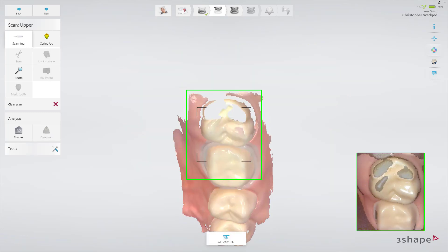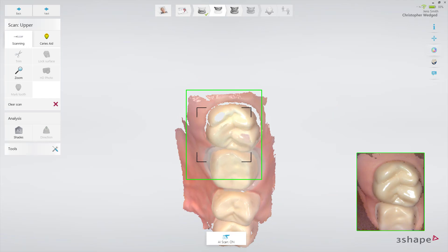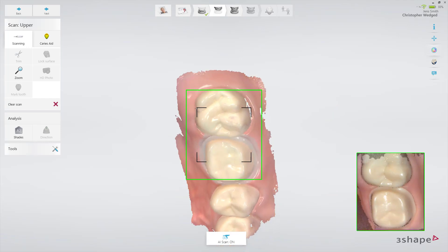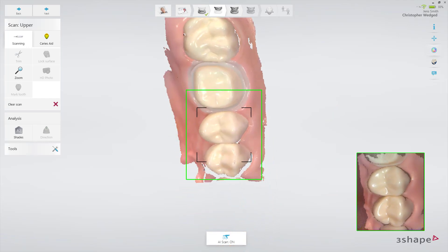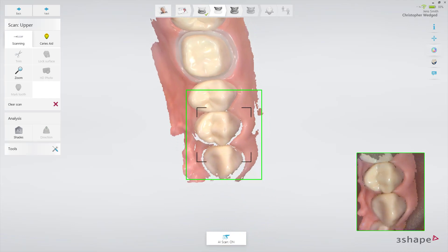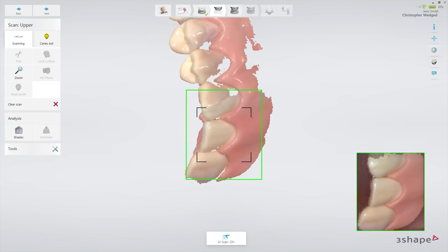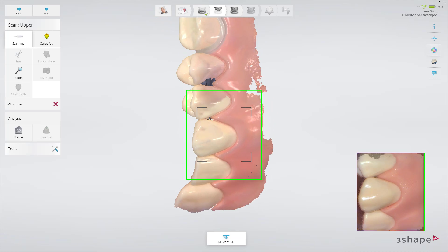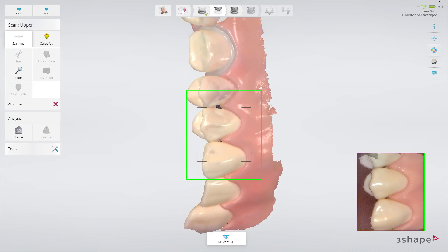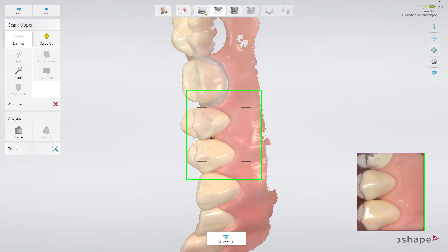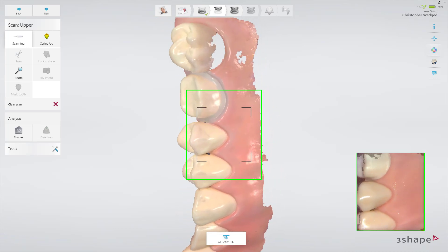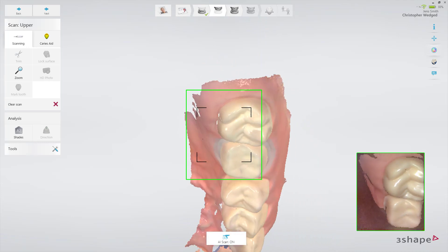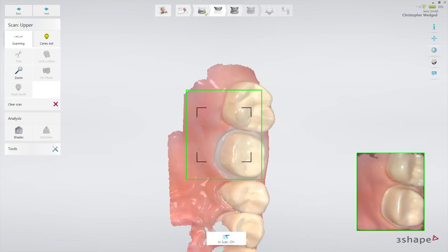Then complete the scan using the official scan strategy, which is to continue scanning the occlusal surface from the preparation to the canine. Then, as it is the upper arch, slowly roll to the buccal side and move the scanner in the distal direction. Finally, slowly roll over the last molar and scan the lingual side.